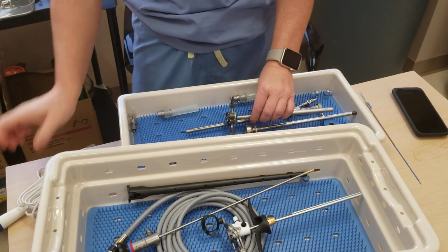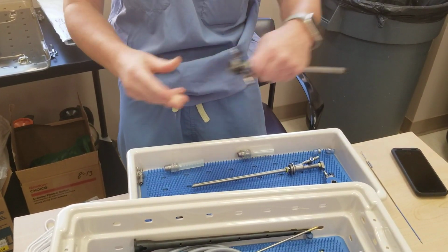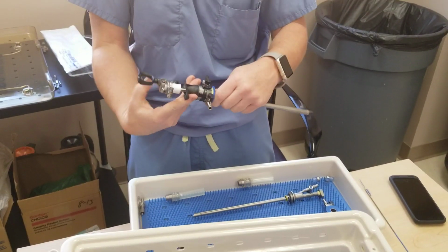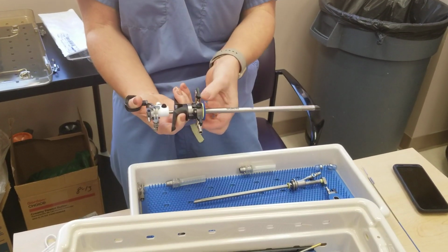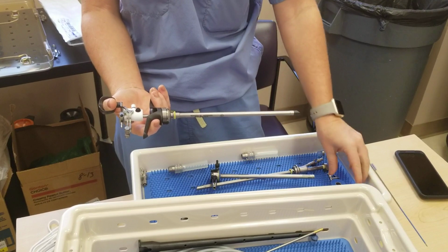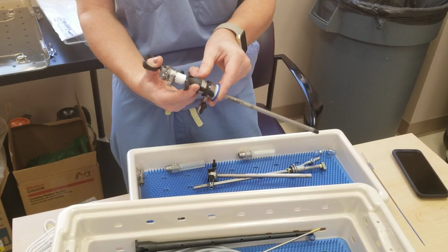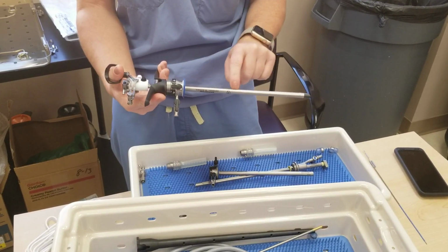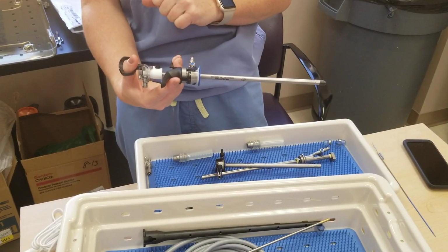So this is a 26 French continuous flow rotating resectoscope. Okay? If this is ever too large, they don't want to dilate up that big, it's an older patient, they just are going to go in really quickly and get one little specimen, you don't have to use the outer sheath, which is again 26. You can use what Olympus calls a collar, stick it on your inner sheath, it just snaps on, you can't do it wrong, and then now you've got a 24 French standard flow resectoscope, okay? And you can resect just like that.